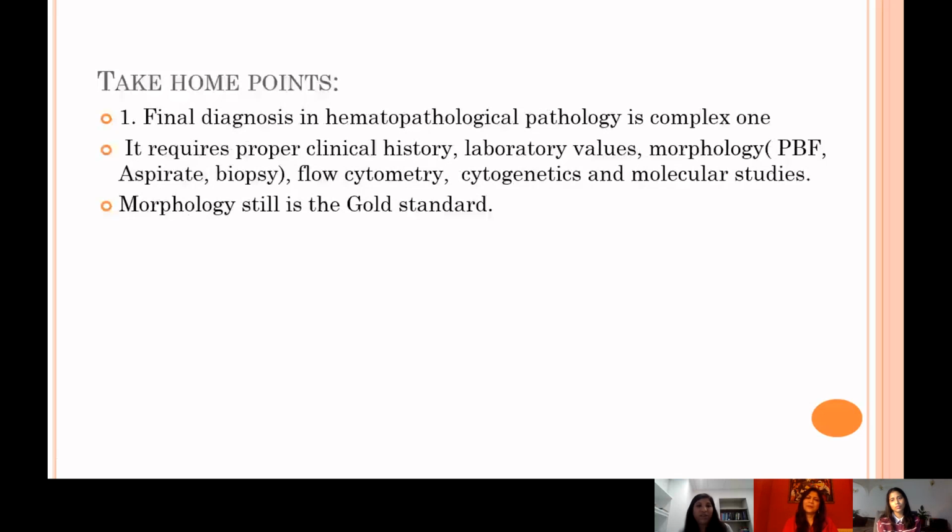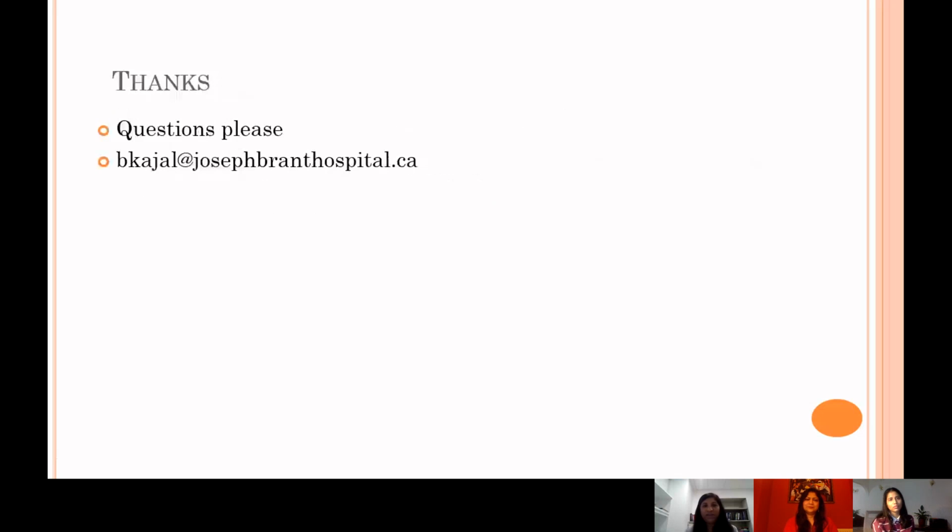But there are still morphological clues, and I would say morphology still is the gold standard, despite all the molecular testing we have available. Thank you so much. Any questions, please? I'll be happy to answer those.